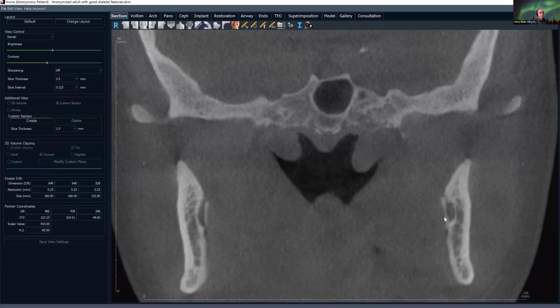Right here, I look at the lingula. So this is where V3 enters. Remember, it exited the skull through the foramen ovale. It travels to the soft tissue. It drops in here. This is important anatomically because this is where we deposit our anesthetic to block these.